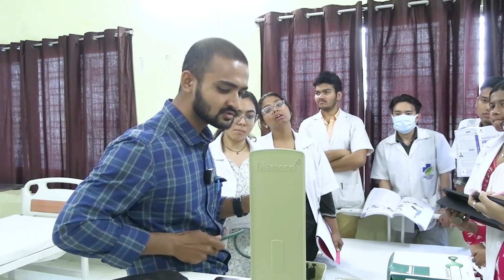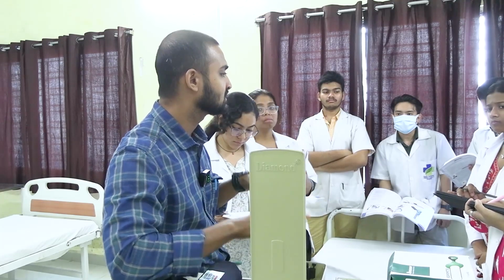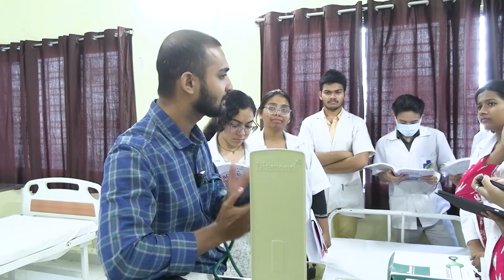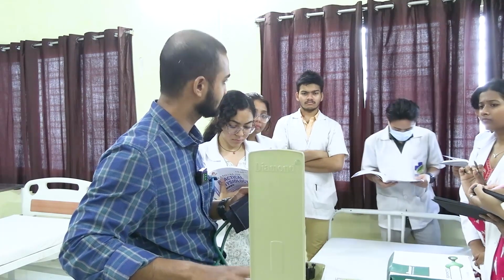So what is the principle of measurement of BP? It is balancing of the air pressure between the cuff, the rubber bag, and the column of blood in the artery. This is the principle.